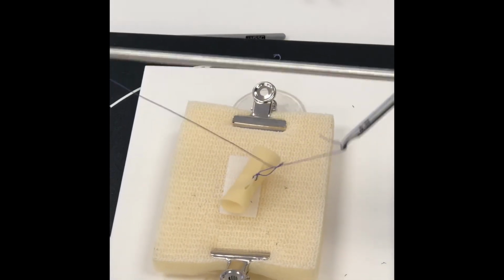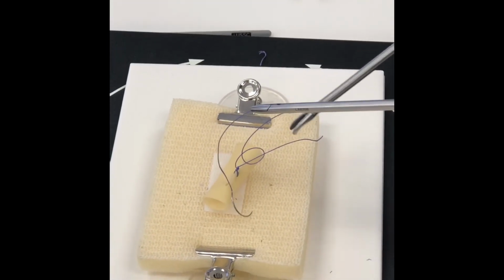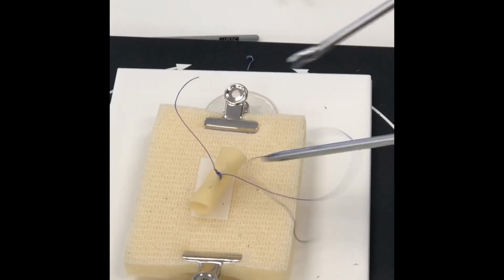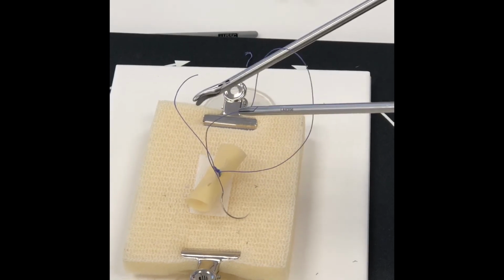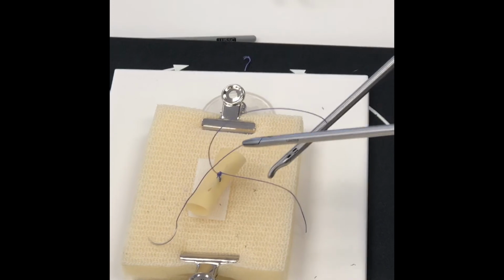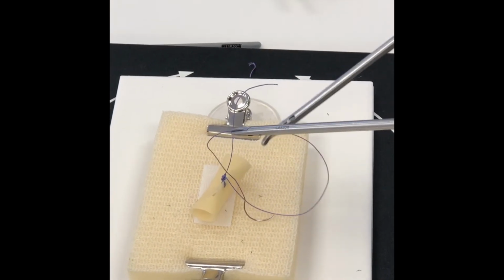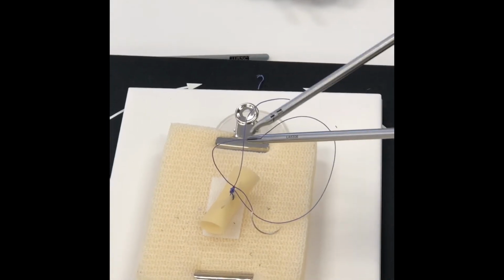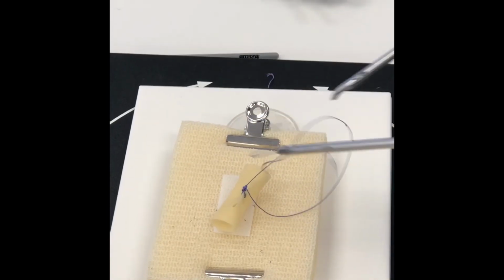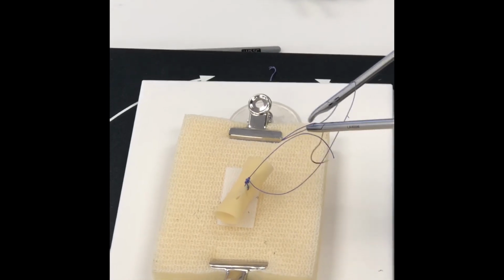close to the tip. So every time that I do this, all I do is bring my suture to my tail, wrap under, tail goes up. Oops. Bring my suture to my tail, wrap over, tail goes down. And I'm just alternating hands, left and right. I can do it as many times as I want to. Suture to my tail. When I wrap, I always bring the suture towards the tail, tips close to each other. I don't wrap like this because you don't have any control. I wrap close to each other and my tips always stay really, really close.